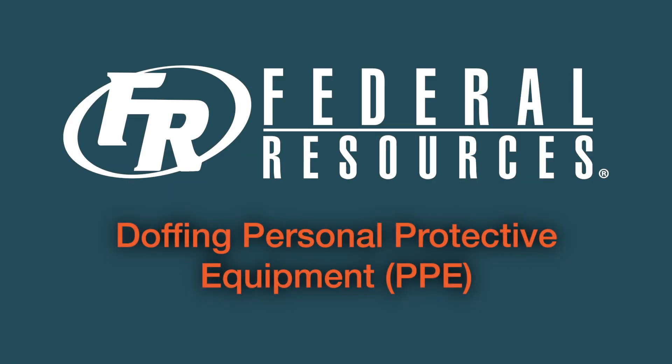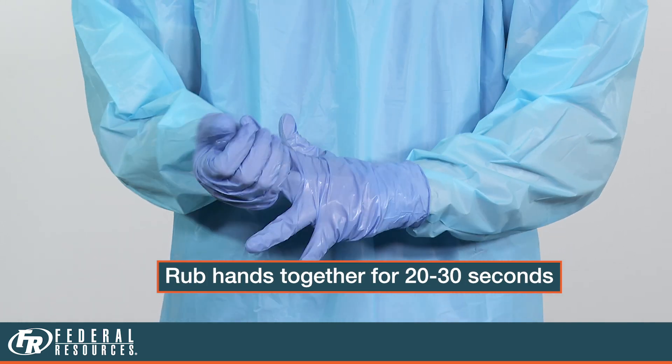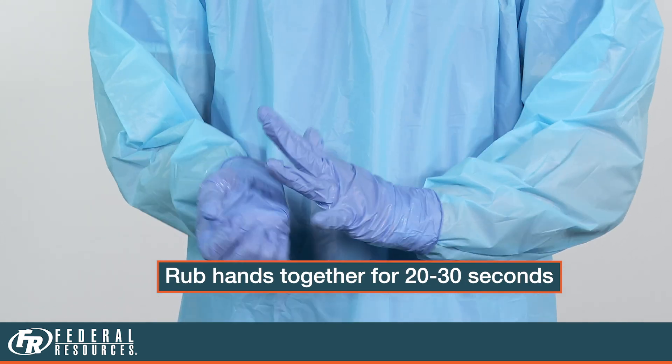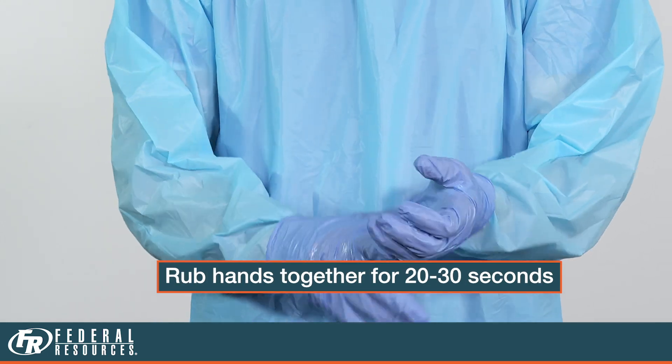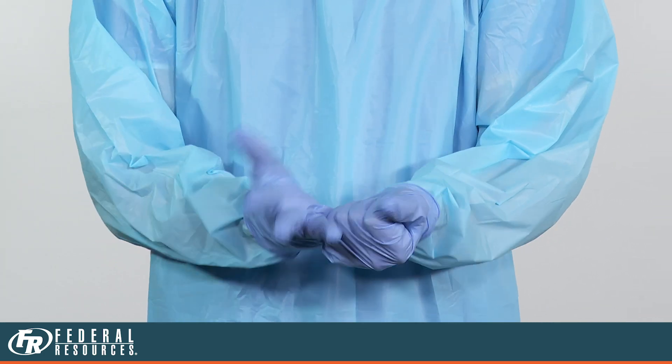Now let's go over the safe removal or doffing of your PPE. The first step to safe doffing is to perform proper hand hygiene. Apply alcohol sanitizer to your gloves. Rub your hands together vigorously for 20 to 30 seconds, making sure to cover both hands and all fingers front and back as previously covered.